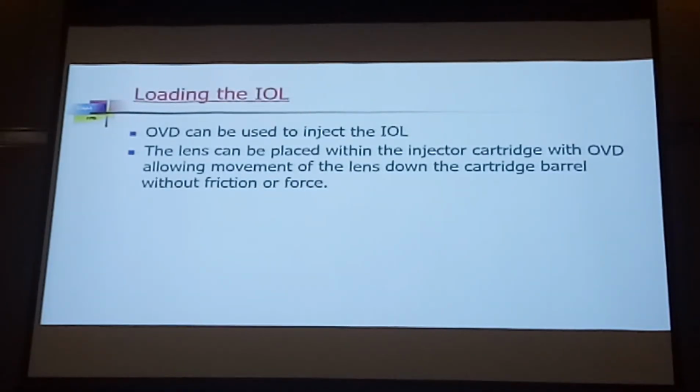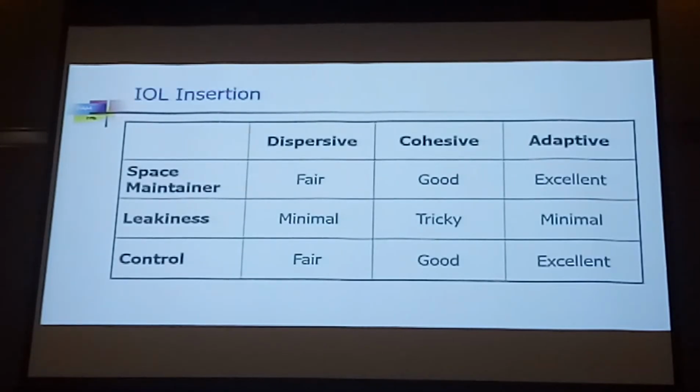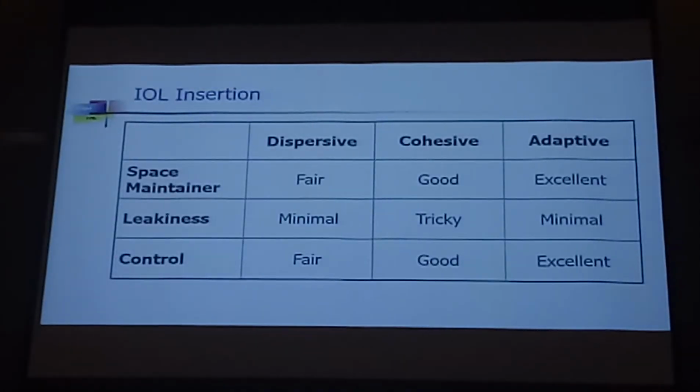Viscoelastic is also for you to load the IOL. So now, whenever you load the IOL into the cartridge injector, you will put some viscoelastic to lubricate the IOL. And then IOL insertion, what is the better viscoelastic? They all, if you're familiar, they all work well. Some better than others.